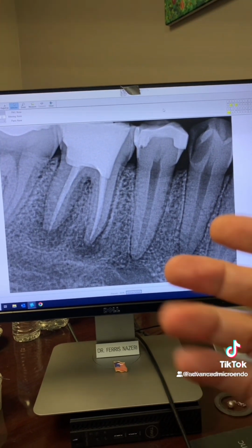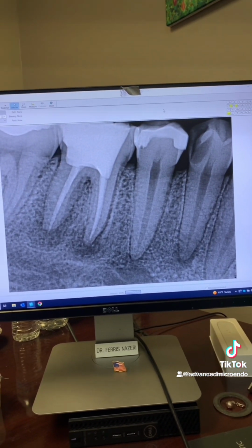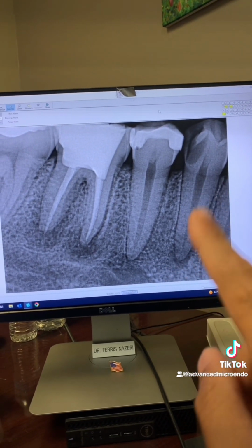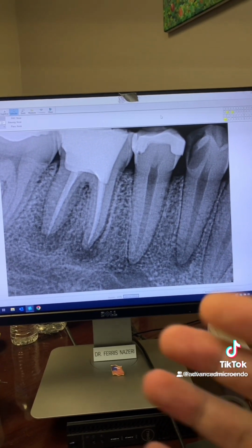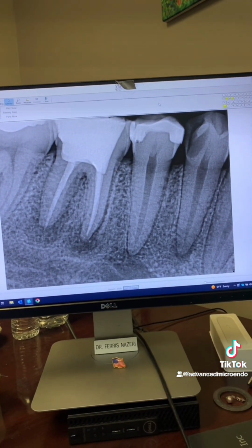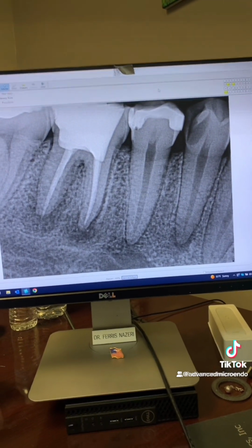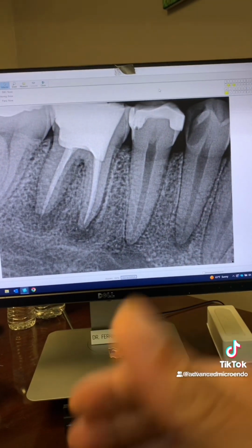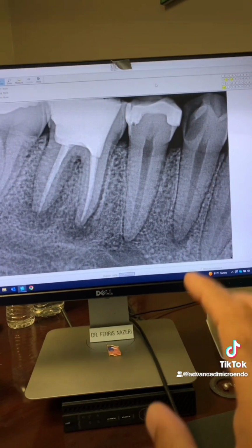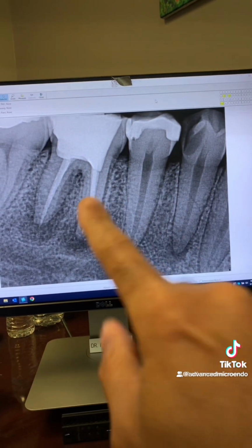And the only time that I need to place an intracanal medicament such as calcium hydroxide is if the canal continues to ooze purulent discharge, then I place calcium hydroxide. Or if I run out of time, so I can't complete in one appointment, then I place calcium hydroxide, temporize the tooth, and have the patient come back. But in the majority of cases, if I can get the canals dry right before obturation, then I can go ahead and do the endodontic treatment or retreatment in one visit.